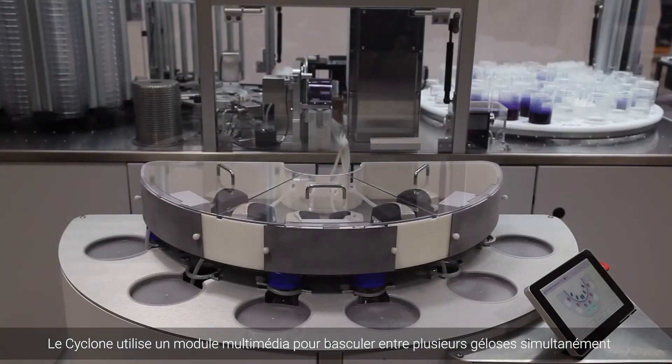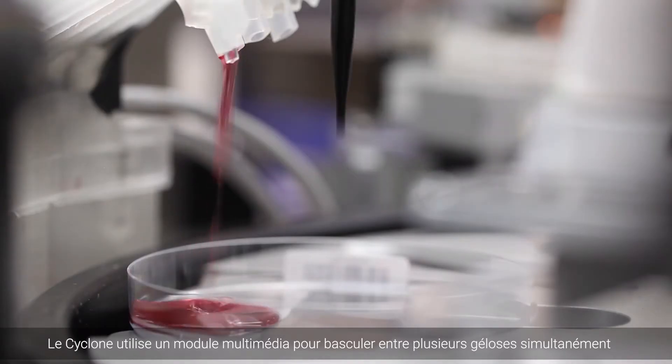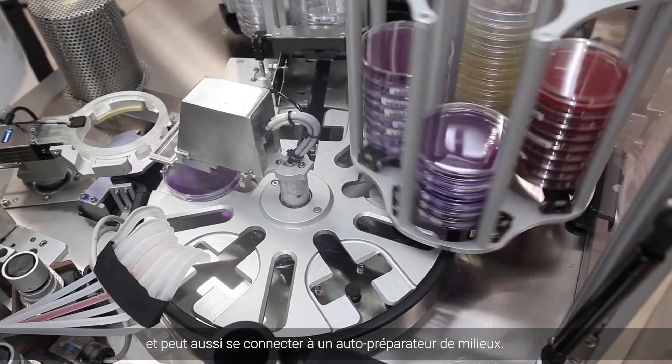The Cyclone's open platform utilizes a multimedia module to switch between multiple agars seamlessly, or can connect to a third-party agar preparator.